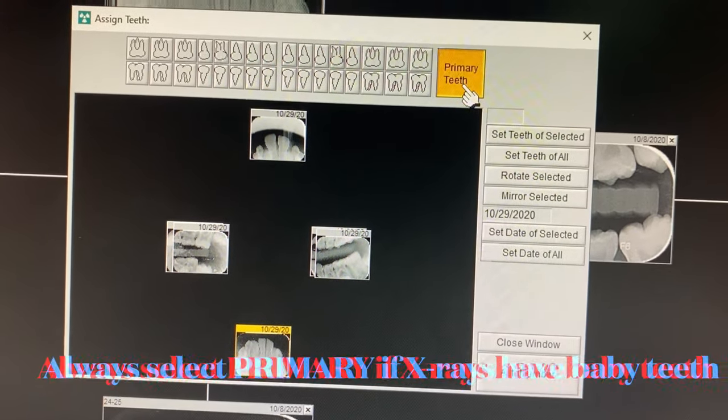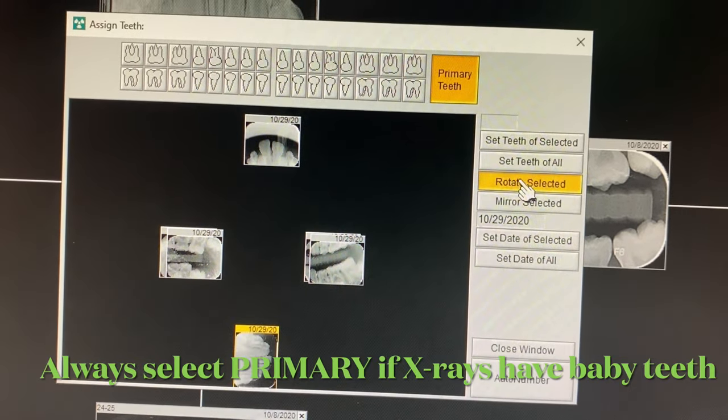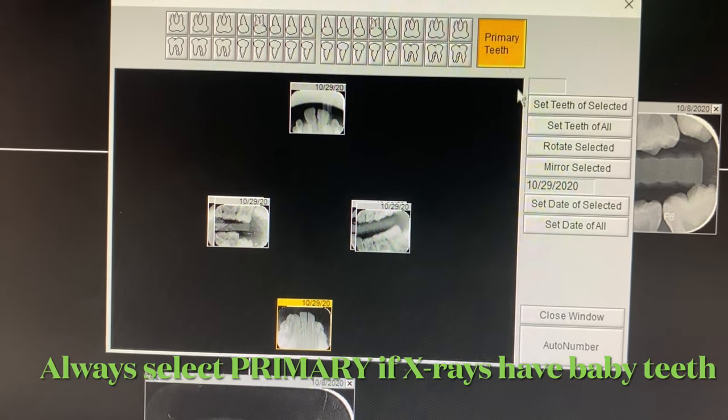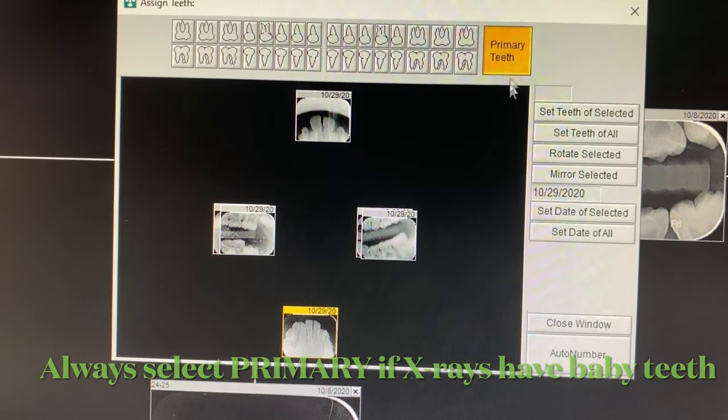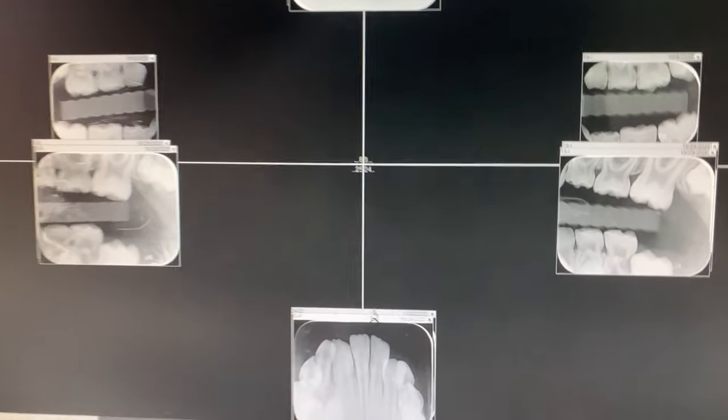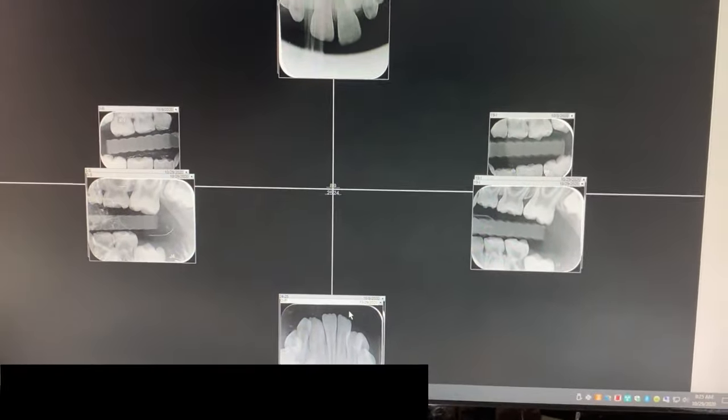Number two: you don't need to rotate teeth manually — the computer will often rotate for you, so you can save that step. Finally, hit the primary button if you have any primary teeth, click auto-number, and voila, they're all indexed.